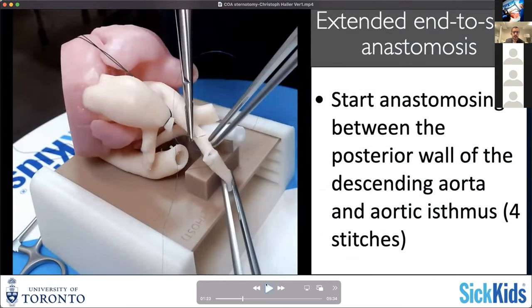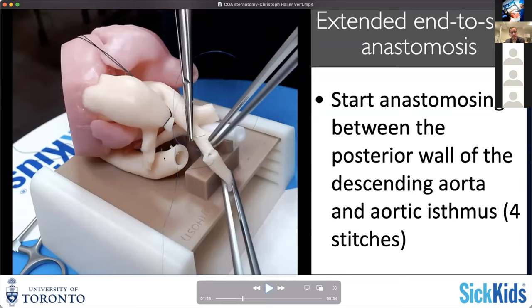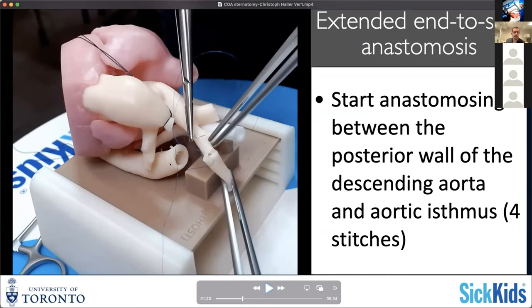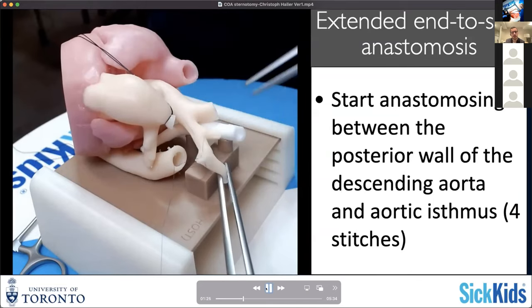We start usually in deep hypothermic circulatory arrest to anastomose the descending aorta to the end of the transverse arch. This can be done with the clamp off. With complete arrest you should not have a lot of blood filling up your field, and it's usually a bit more convenient and easier to expose. You do that while in deep hypothermic arrest before then initiating selective cerebral perfusion after the completion of that partial anastomosis.